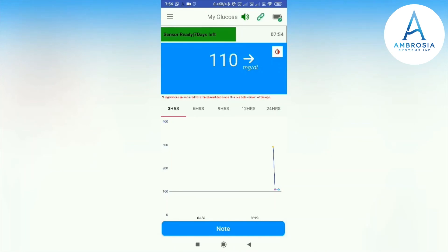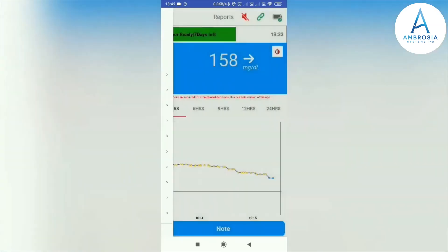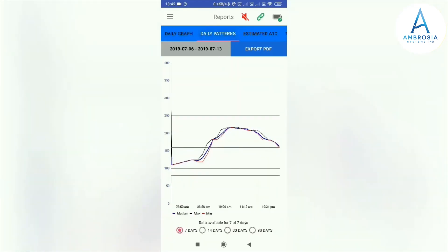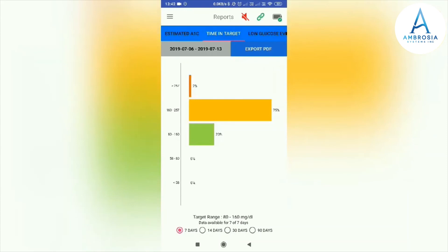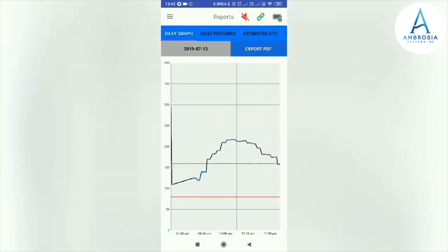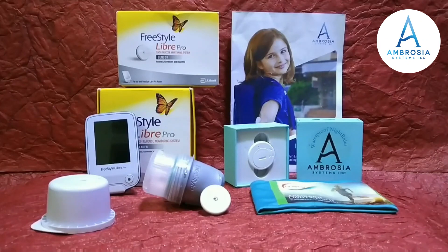This is the main dashboard screen of the LinkBlueCon app, showing your glucose level every 5 minutes. Moving to the reporting section — this shows the daily pattern of your glucose level. This is your estimated A1C level, time in range, and the maximum time your glucose is within range over a period. This graph shows low glucose events. If you want to export your report as a PDF, you can send it to your email by clicking Export. This is how you can convert your Freestyle Libre Pro flash glucose monitor to a CGM using the Ambrosia BlueCon Night Rider and LinkBlueCon app.